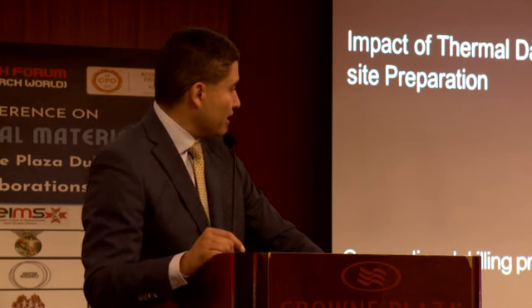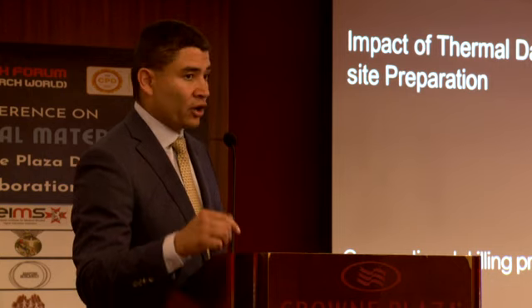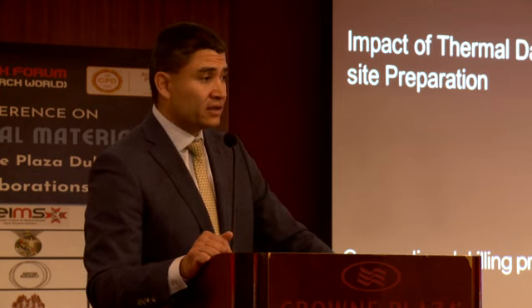What we see is that the heating element of the drill, as it penetrates the cortex and continues on, reaches temperatures above 100 degrees Celsius with internal and external irrigation. So what that means for us is that we are killing the cells immediately as we are drilling our osteotomy. Now, but wait. So what?